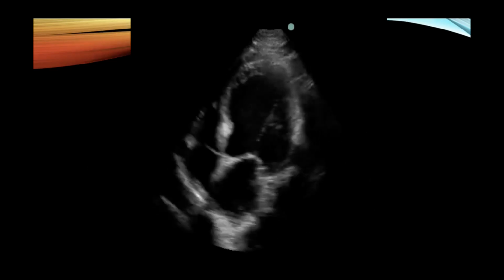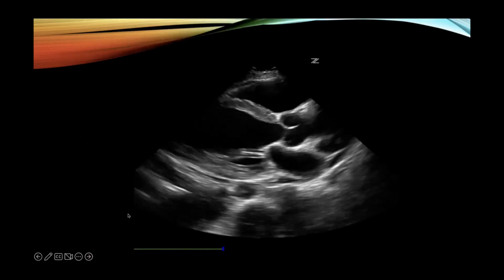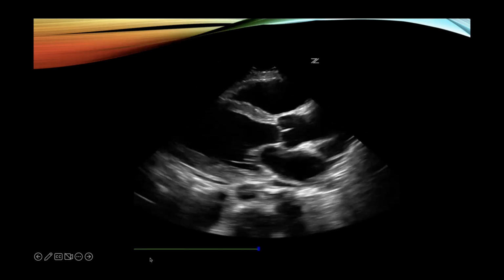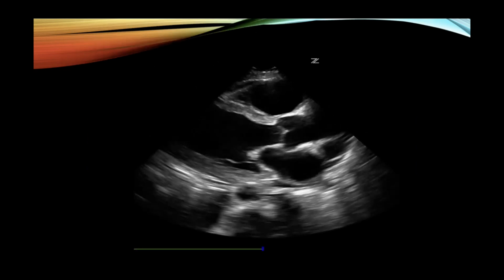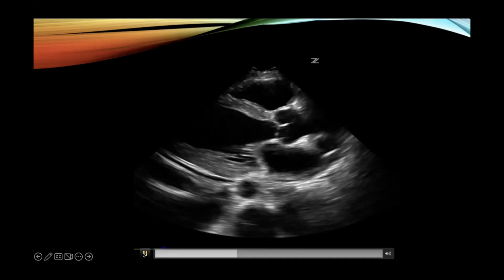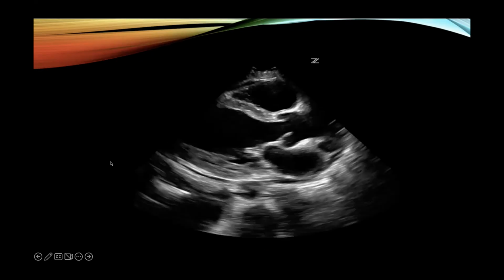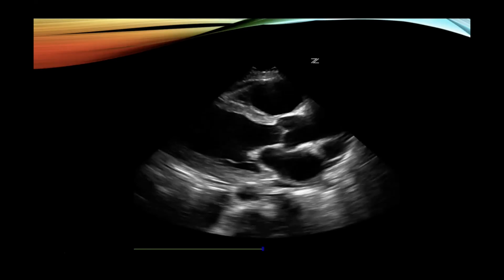I don't remember what I was trying to show you on this image. Okay. What do we think about the squeeze on this patient, Chris? So we're not seeing very good squeeze. Doesn't look like the anterior mitral valve is getting even close to the septal wall. So it certainly has low cardiac output, or at least, yes.